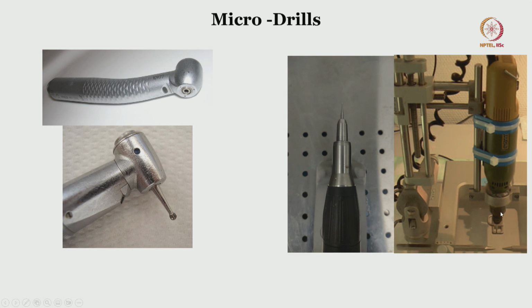So it's very important that you either use these adapters or use a freehand technique to drill, and know when the depth is reached or when the dura is reached. It's very important that you don't puncture the dura, because once the dural puncture is done with the drill, it is understood that the brain is injured under the area of the puncture. Alright, so these are two types of drills.